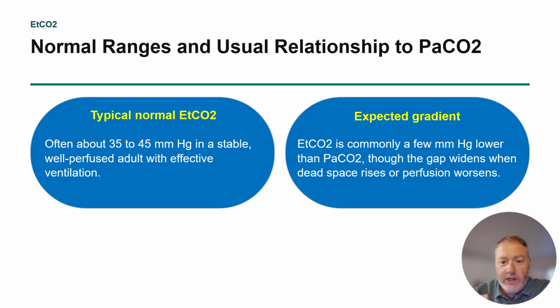It could be a perfusion issue. It could be a dead space issue. It could be a metabolic secondary issue. So jumping to conclusions with, oh, they're getting more hypercarbic or more hypocarbic, may or may not be due to the respiratory component of their process.